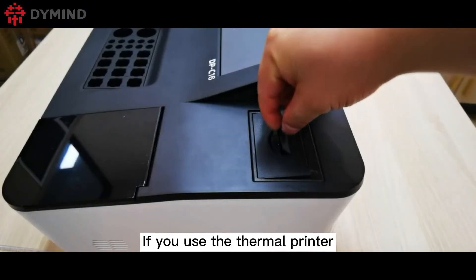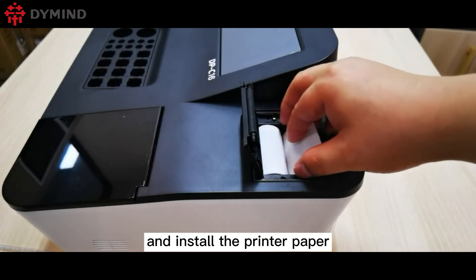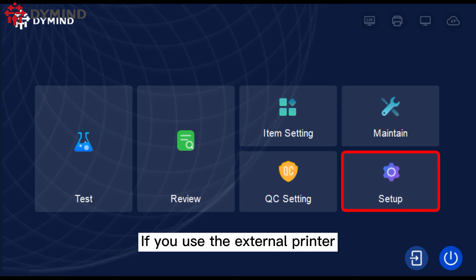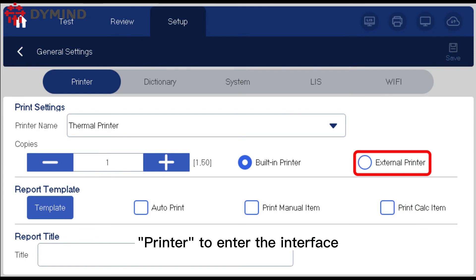If you use the thermal printer, please open the shell of the printer and install the printer paper, then cover it. If you use the external printer, please connect the external printer and click Setup > General Setting > Printer to enter the interface, then click external printer to select the printer you installed.